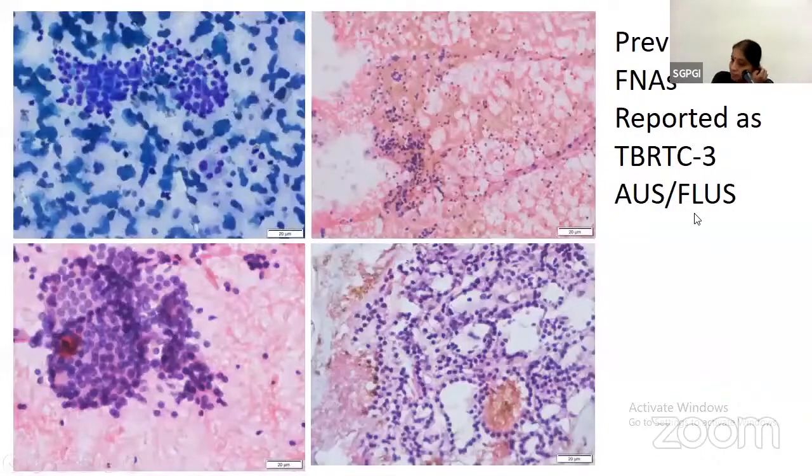And this is the needle in the lesion, ultrasound guided FNA done. Looking back, this patient had had 2 previous FNACs from the thyroid, and both had been reported by us only as category 3. Why? Because of technical reasons: the aspirate was diluted, with low cellularity, and we saw only a few microfollicles, so not very conclusive. The rest of the history was not known. A cell block had also been taken at that time, but nothing had been done further.